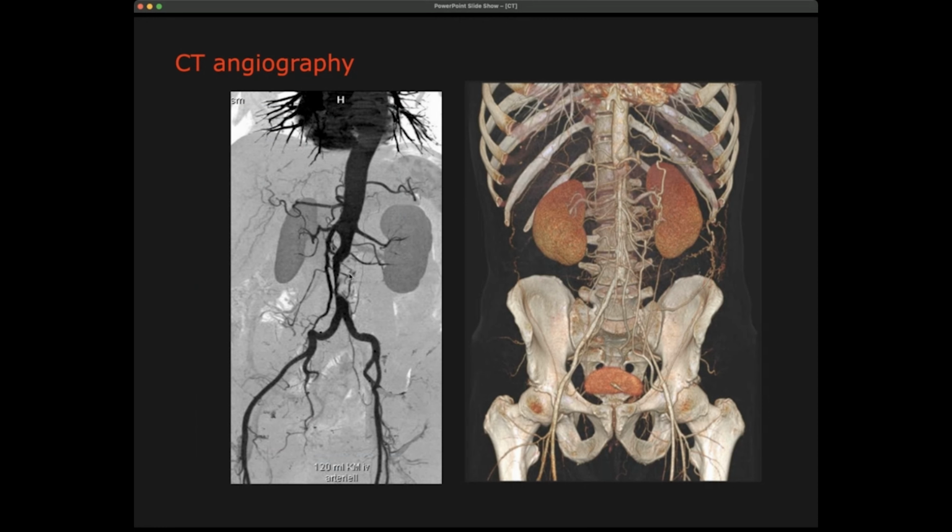And what you see here is an aorta where normally a normal aorta would be kind of smooth and would be tapered. So that would just slowly become smaller and smaller whenever the side branch is coming. And then later on split into the two iliac arteries, as we say, so going to the two legs. But what you see here is that there's a sudden change in the diameter. So here it becomes suddenly smaller and then becomes thicker again. So this is clearly an abnormality. So this is based on large atherosclerotic plaque that is being accumulated there. So the diameter of the aorta is partially changed because of this.